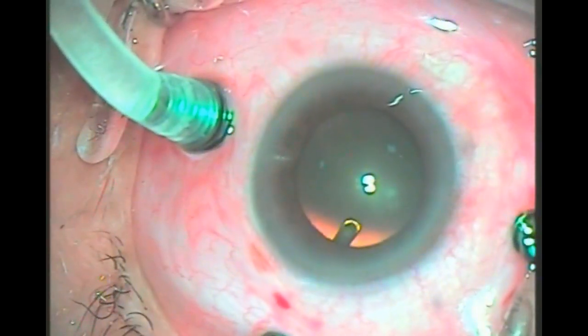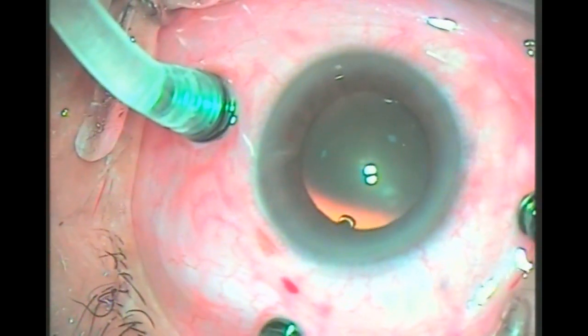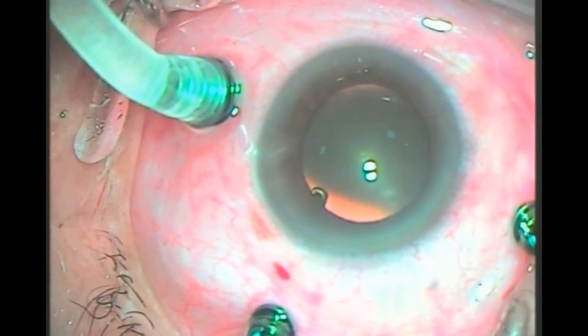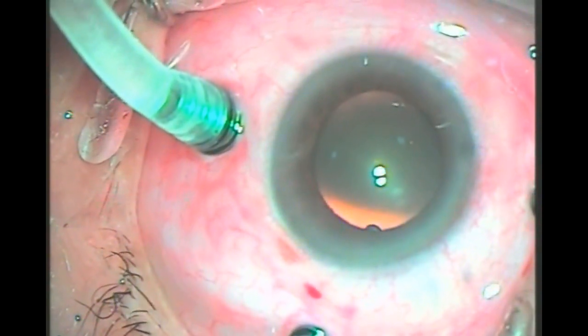Anterior vitrectomy is the very first step for any vitrectomy procedure. Achieving a good anterior vitrectomy is the prerequisite for a successful vitrectomy procedure. However, incomplete anterior vitrectomy often leads to primary posterior capsular opacifications, probably resulting from the metamorphosis of residual hyalocytes in the anterior vitreous layer.